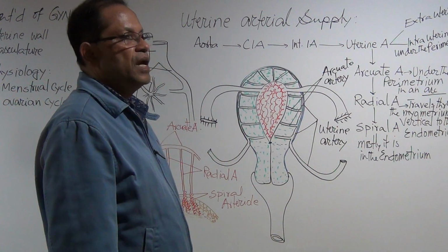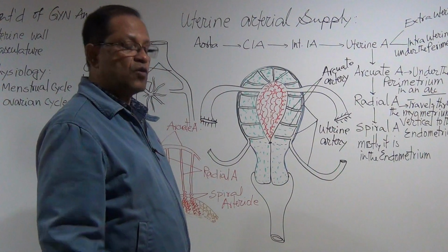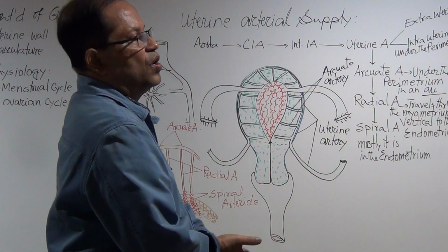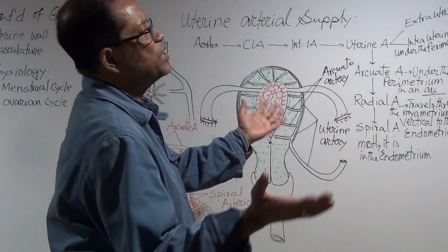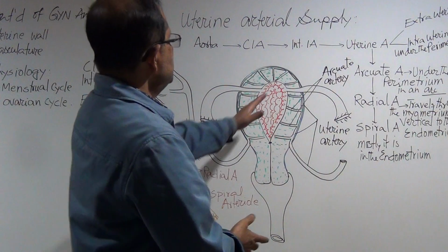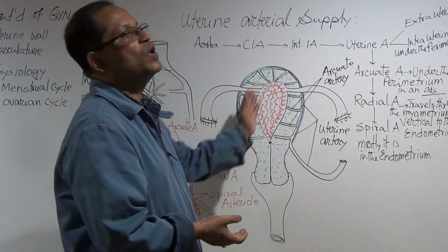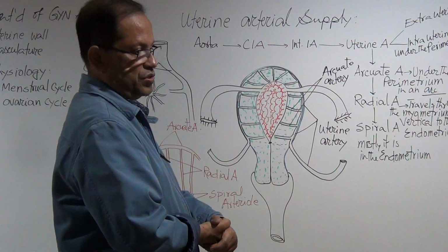So, hemodynamically, the other side, the contralateral uterine artery, will have more flow, even may have more velocity. It depends on the total resistance. If the resistance is overcome, then there will be a nice peak systolic velocity, normal range, but the flow will be increased to compensate the blood to the uterus.